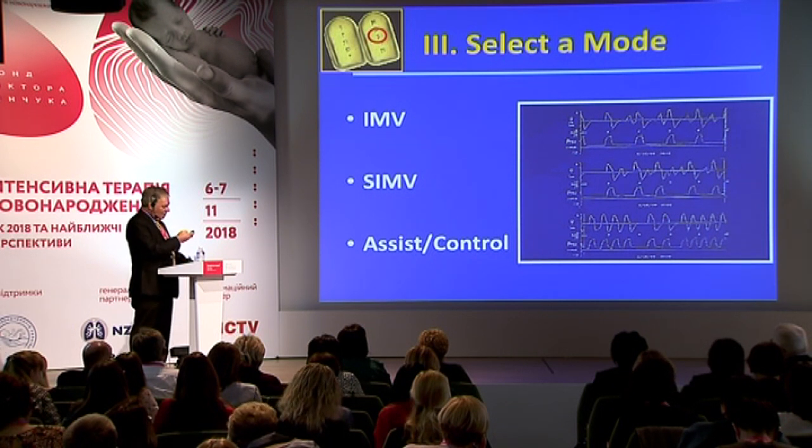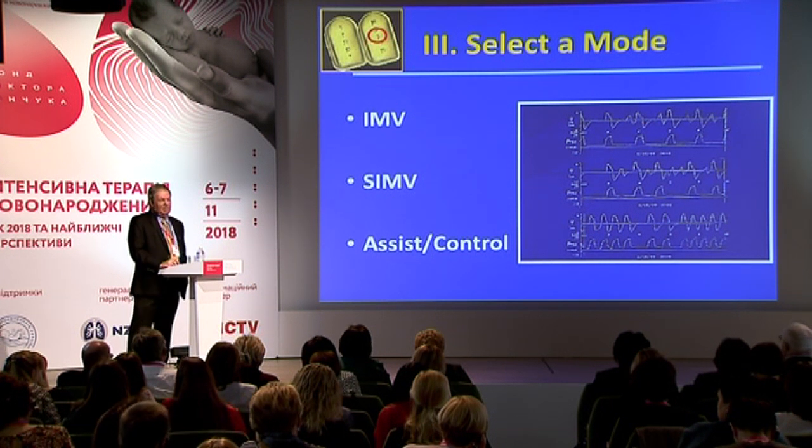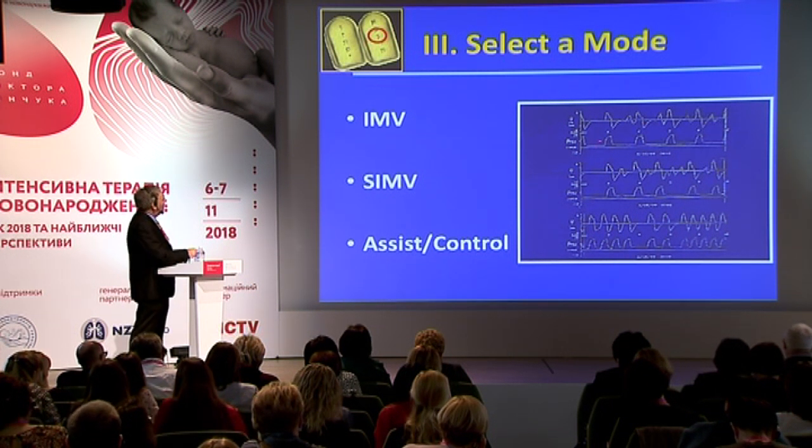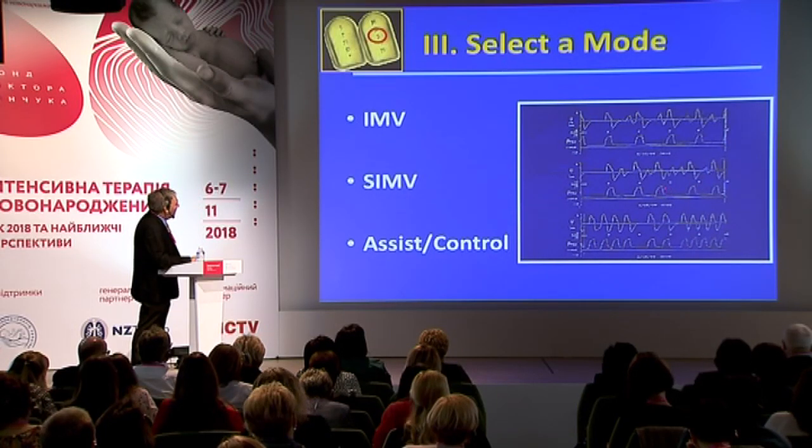It's not a good situation for gas exchange, and it's been associated with significant morbidity, including an increased risk of intraventricular hemorrhage. The first breakthrough came with the development of synchronized intermittent mandatory ventilation. And when you compare these two graphics, they're very similar, but there is a subtle difference. You see that the mechanical breaths are not spaced exactly 2 seconds apart. Even though the ventilator here is set again at 30 breaths per minute, these breaths are 2 seconds apart. These two breaths are not. They're closer than 2 seconds apart. Then there's a gap that's longer than 2 seconds.